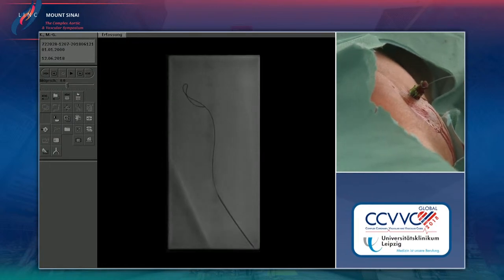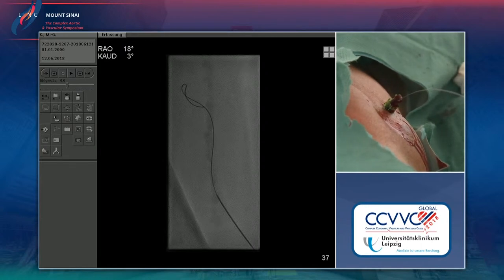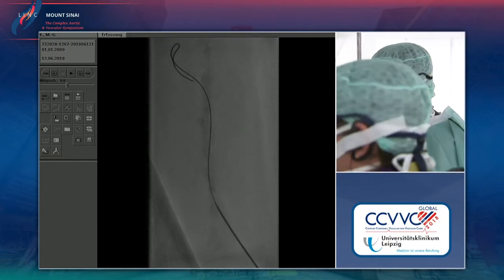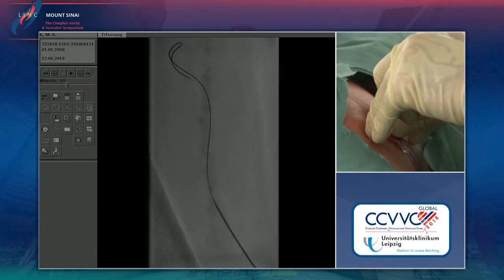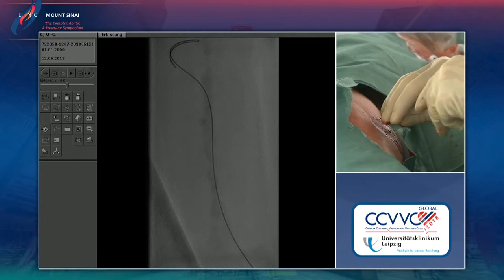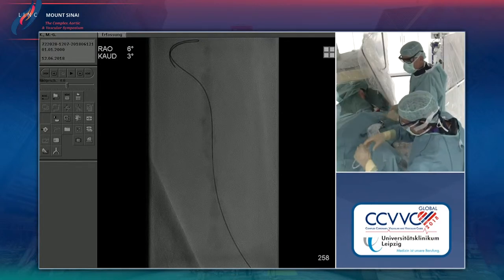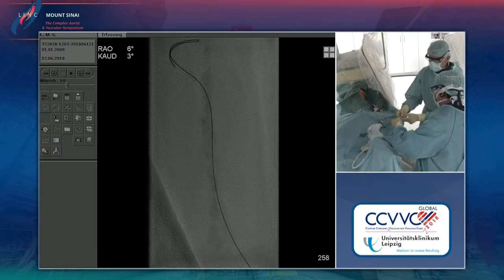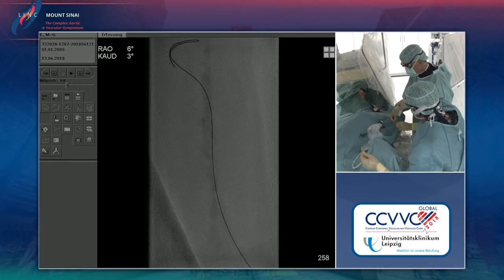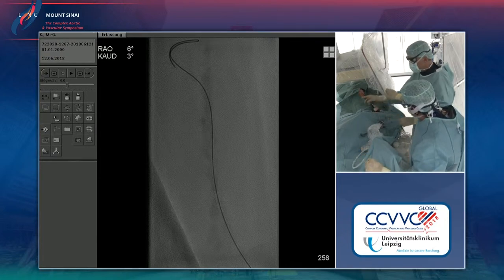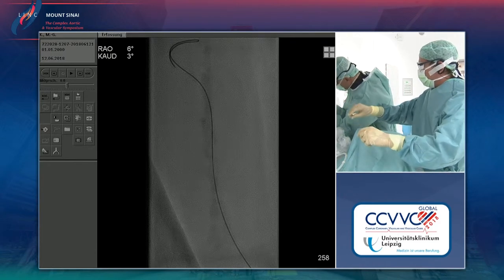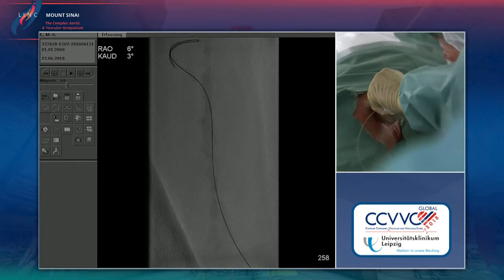Now we try to take a catheter in. Before we continue, I take the needle — as you can hopefully see on the needle tip — and I try to rotate the needle in the anterior wall to enlarge that hole here. Then we introduce a support catheter — the QuickCross 0.018 platform — and hopefully it gives us enough support to go through the calcium.